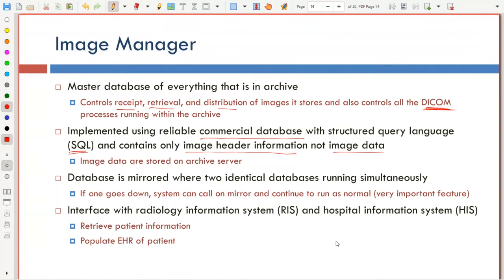All such data is not going to be very large, so you can store it in a reasonably sized database and query it relatively fast. This is what is done right now, using the regular database systems that are used for pretty much any other application.